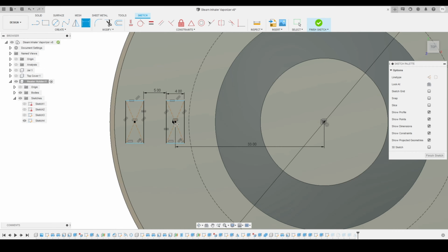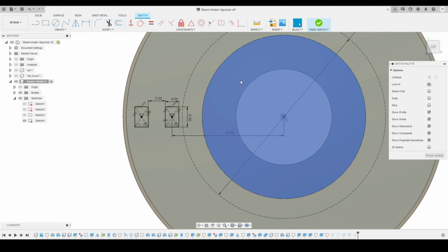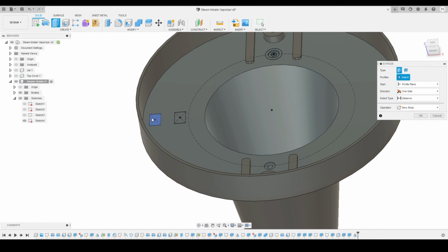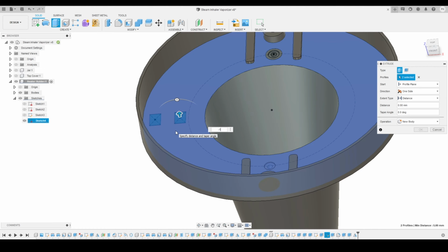Here you can see. Now I will define the total length of this rectangle. So this one I just want to keep 6 millimeter. So this is what we had created so far. I think we can finish the sketch, and now I will turn on the sketch again. So here you can see we got the profiles. We'll activate the extrude tool and make a cut like this.